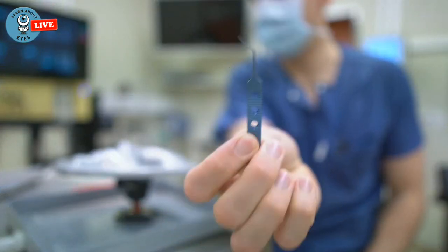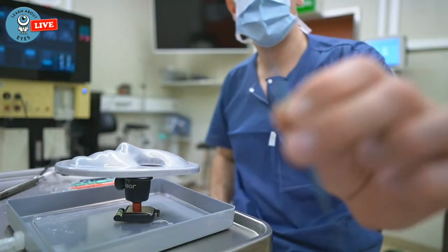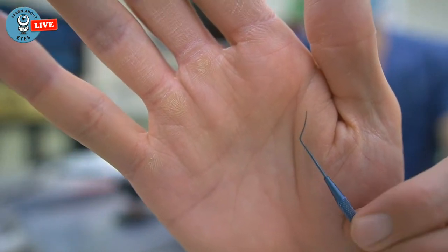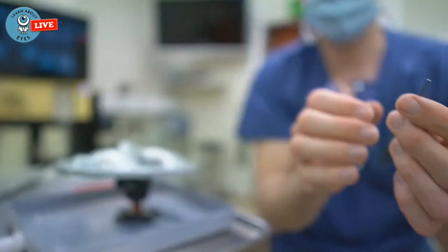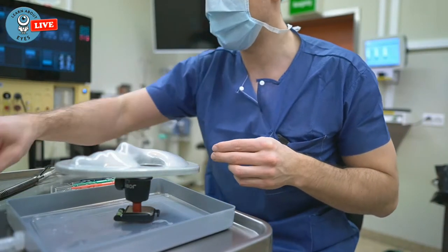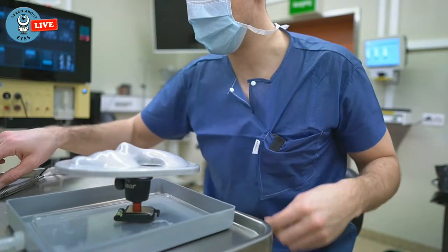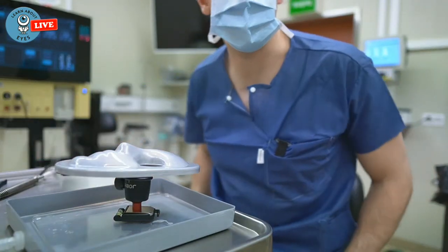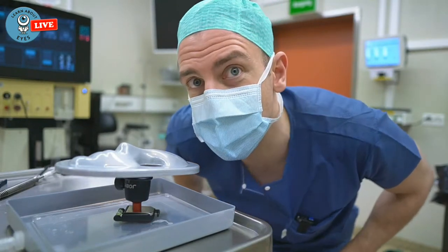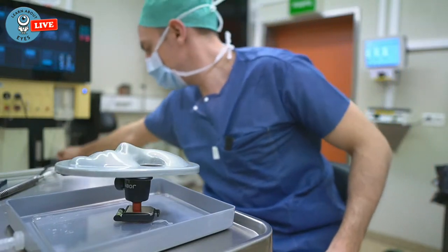We're gonna need our forceps. And I'm using actually a spatula. Sorry, it's too thin for that. So I'm actually just using a spatula because this is the only thing that's on our set, and this is what my boss is using. So I'm kind of trying to just use what he uses, but it does make cracking a whole lot more difficult. Or I think that is it. Maybe it's just me. I don't know. Okay, so let's get this closer.